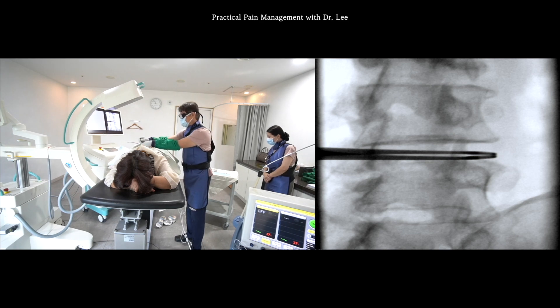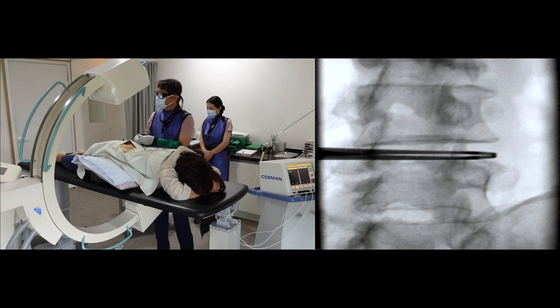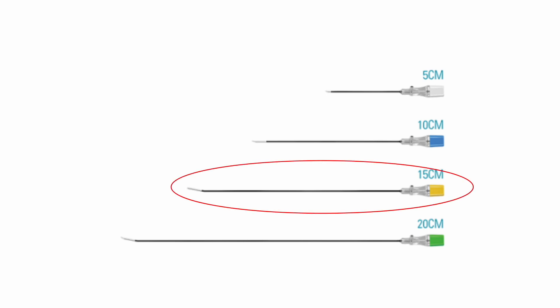I begin inserting the RF cannula at the L4 root. I usually select the 21 gauge, 15cm long, curved needle tip type for the lumbar spine.